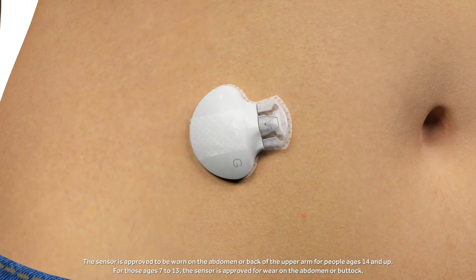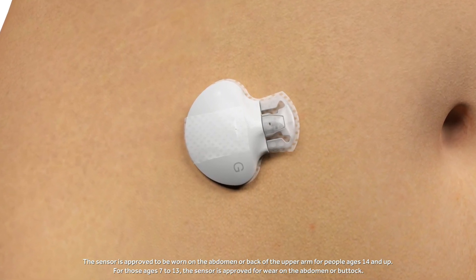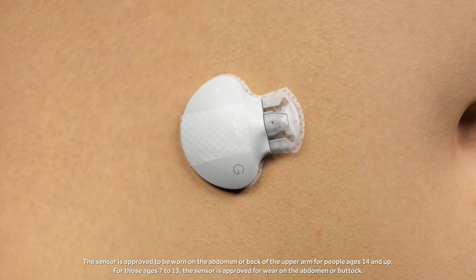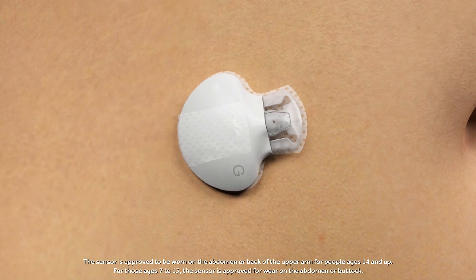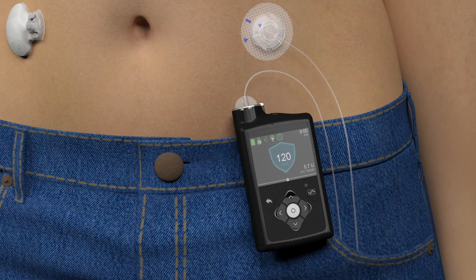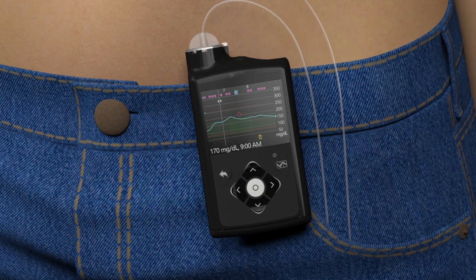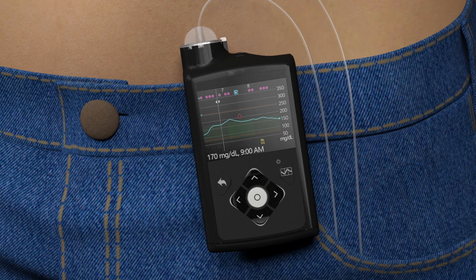The Guardian Sensor 3 features an extended life of up to seven days and can be worn by most people on the abdomen or the back of the upper arm. The sensor continuously monitors glucose levels and automatically sends that information to the insulin pump every five minutes. Based on this data, a personalized amount of insulin is delivered to help maintain a target glucose level.